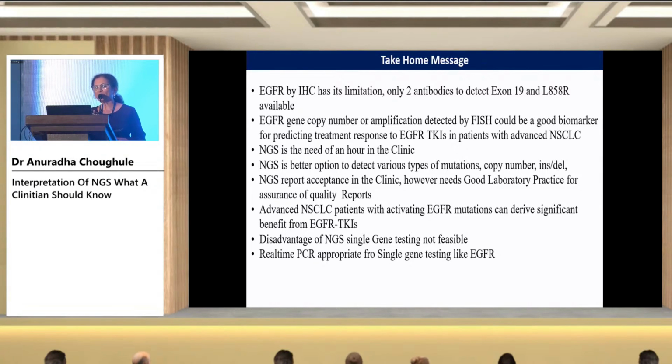So, take home message: EGFR by IHC has its own limitations. EGFR gene copy number or amplification detected by FISH could be a good marker for predicting treatment response to EGFR TKIs in patients with NSCLC. NGS is the need of the hour in the clinic. It is gradually being adopted in the clinic because it detects, in a single go, the mutations, copy number, insertions, and deletions.